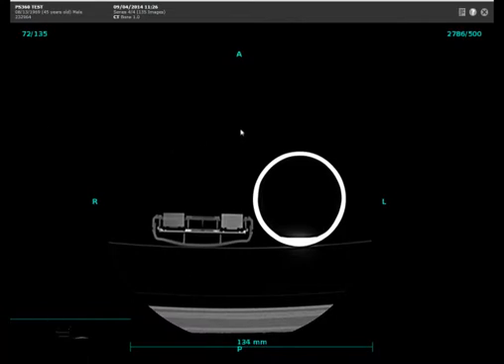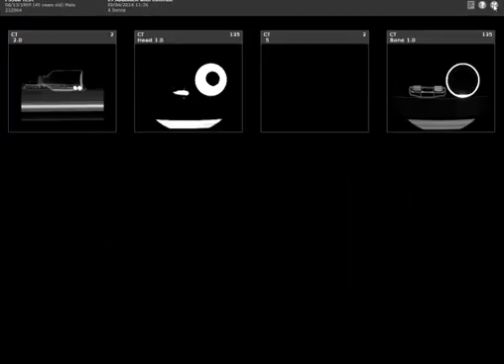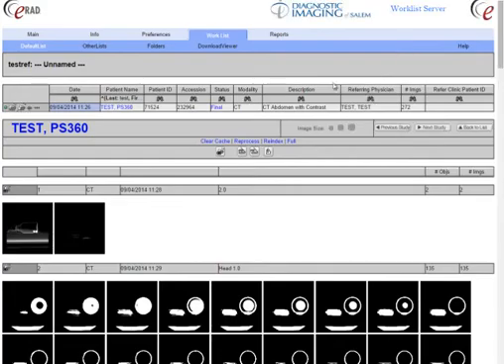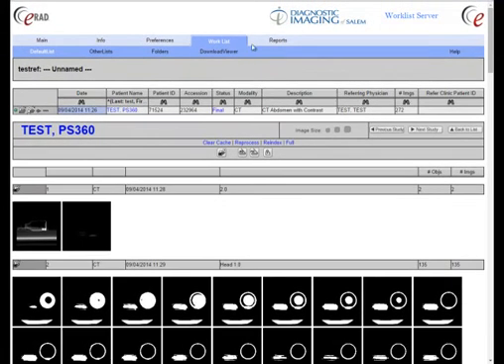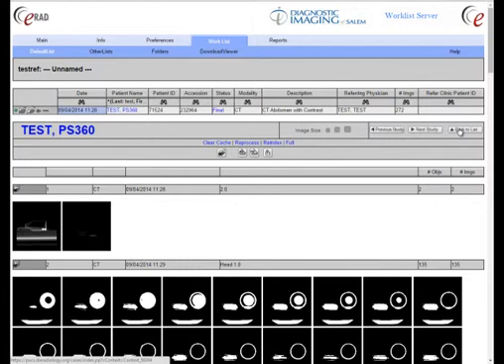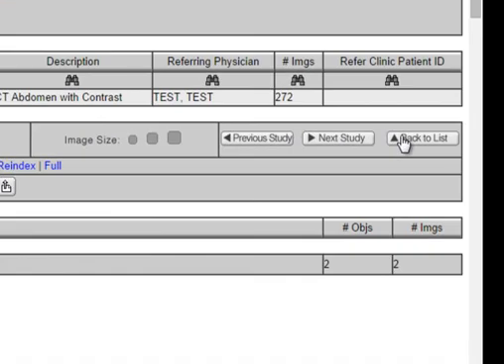If you require more functionality than the few things we can do in here, you might want to consider downloading the viewer. The link is right at the top of the page — here is the download viewer. That's going to require some admin rights on your PC, but it will give you a lot more capability — you can do annotations, measurements, and such. The 'Back to List' button is usually your best bet for returning; you can hit the back arrow, but sometimes it will take you back to your default list instead of your filtered list.